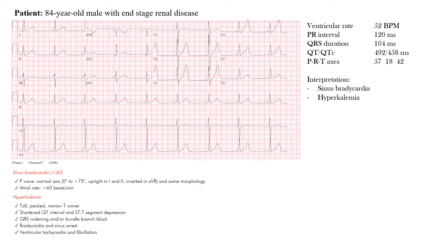Here we have a 12-lead ECG of an 84-year-old male with end-stage renal disease. Take a moment to pause the video and look at it, then we'll go through this together. This patient with end-stage renal disease is coming in with this EKG, and the main features I want to get across are hyperkalemia — we're going to focus on hyperkalemia and the findings we see in this.